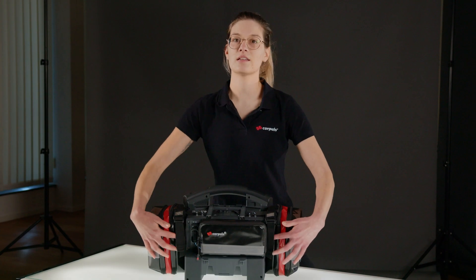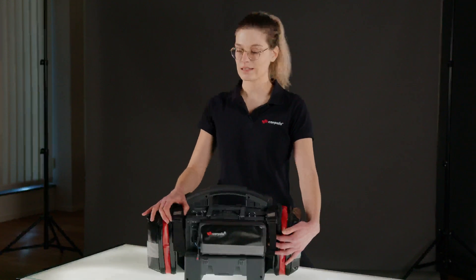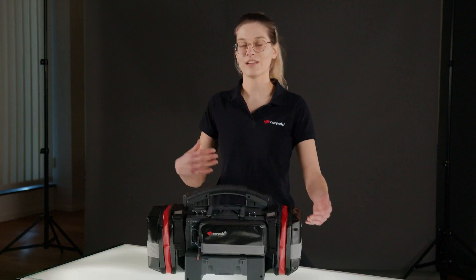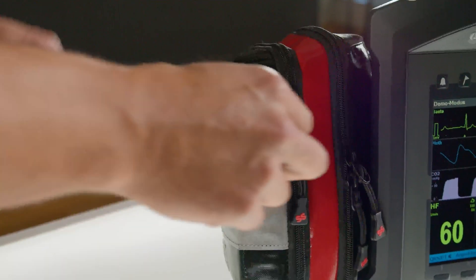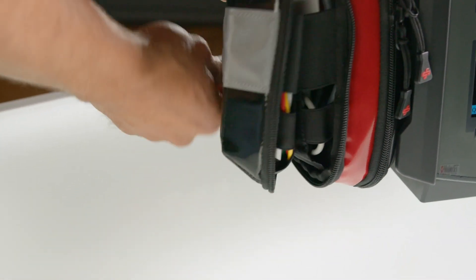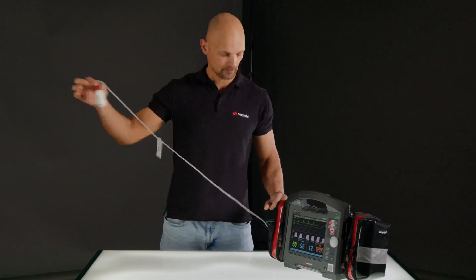You can also see these two belt loops, which have a magnetic closure at the top. They can be easily opened and closed by sliding. If you are using the device in modular mode, you can use them to attach the patient box. When opening the bags, be sure that the zippers are completely open. As an example, I take the pulse oximetry cable out.